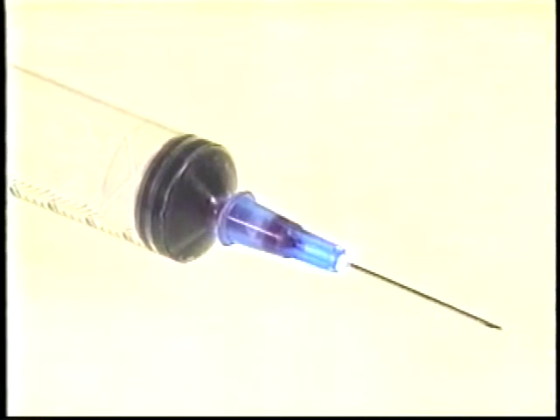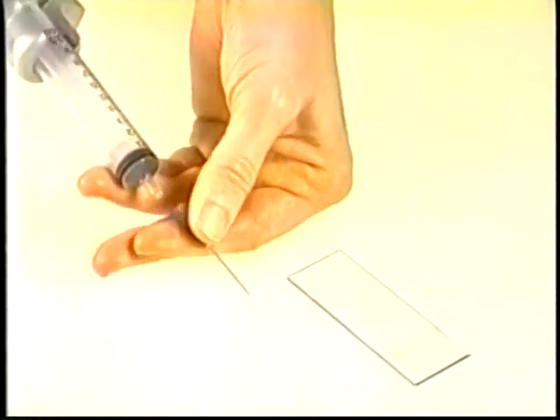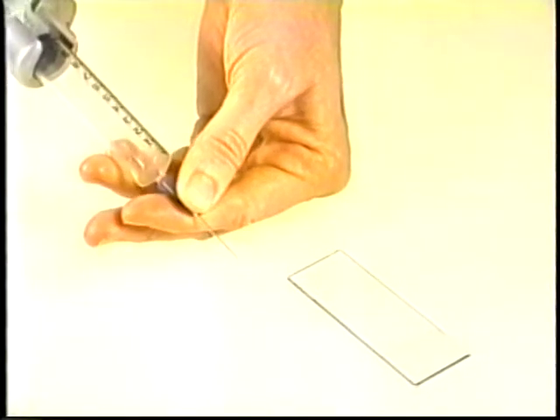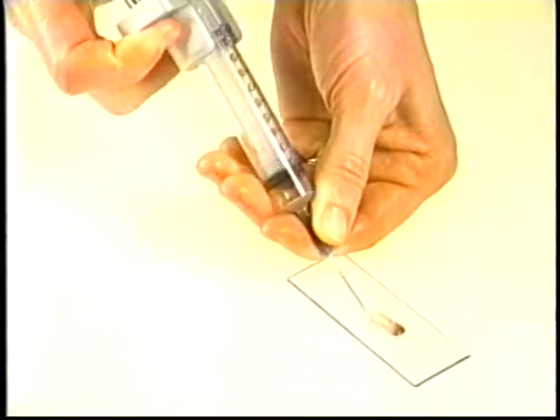By pushing the plunger slowly in order to control the output, there will usually be significant material left behind in the needle. Therefore, I suggest finishing off by detaching the needle and pulling back the plunger for a final, forceful, quick expulsion of the remaining tissue.